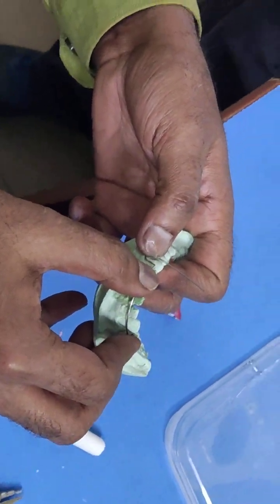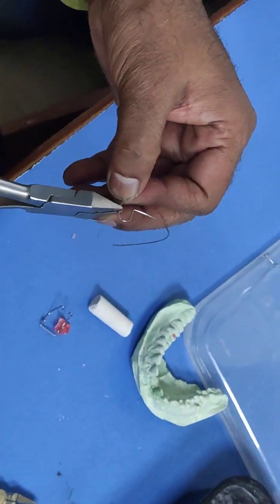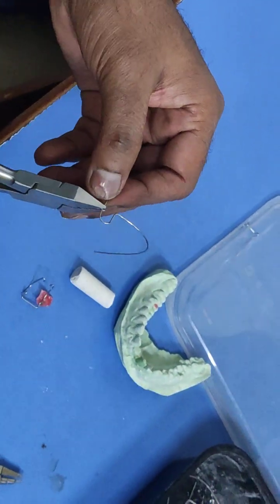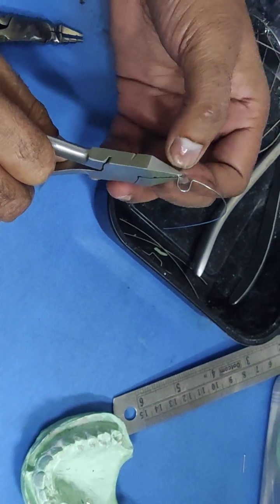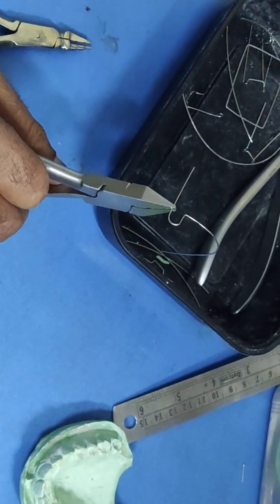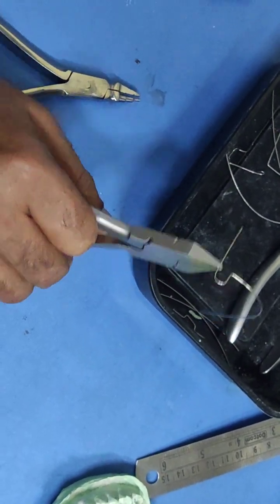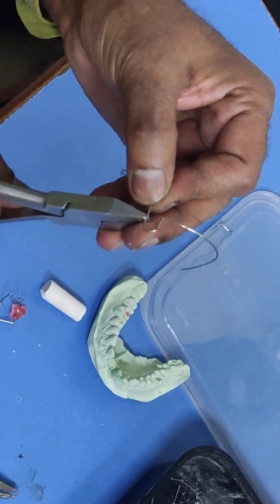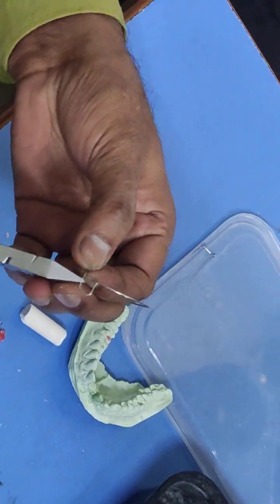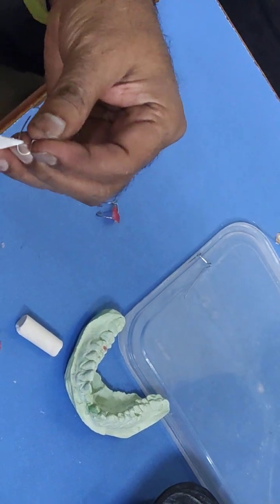So hold it. If you hold it here, at the level of the curved section, what will happen? The bend will be a little bit elevated from the contact point, which should not be so. So better you hold it at a little lower position, so that after bending, the gentle curved portion becomes at the same height.